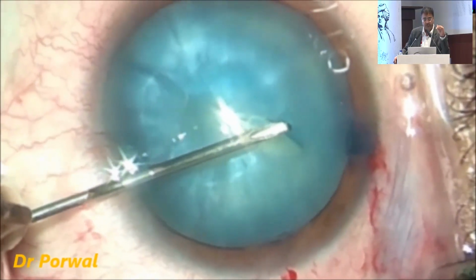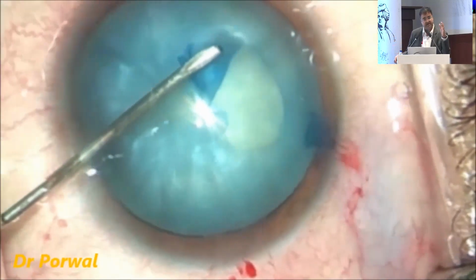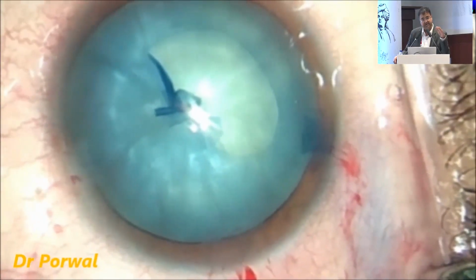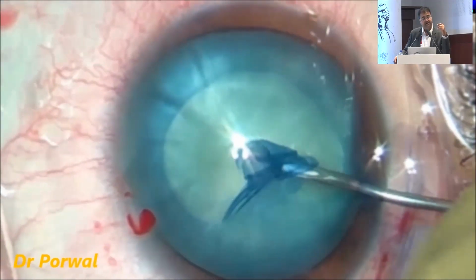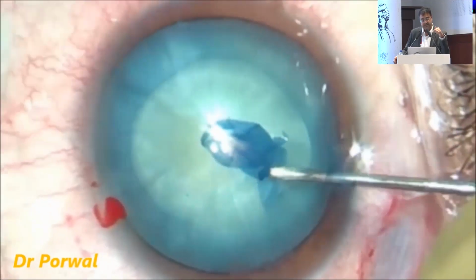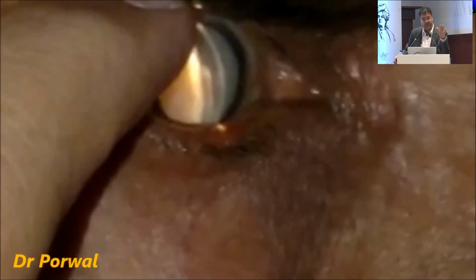First tear, what you are going to do. You have to make sure that you practice your rhexis with both right hand and left hand. In your cataract set, you should have rhexis forceps, a capsulotomy needle, as well as a 25 gauge micro rhexis and micro vannas. If you have not started eating with your left hand, start eating with your left hand, start using your left hand, because you don't know which hand you are going to use. In this case, my initial rhexis was large enough, so I didn't have to refashion it.